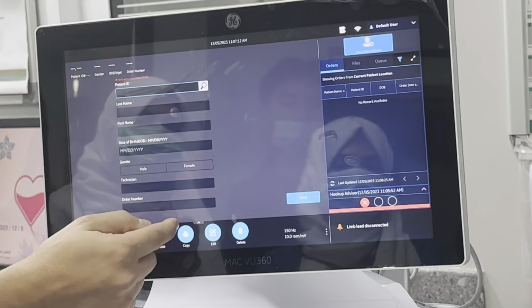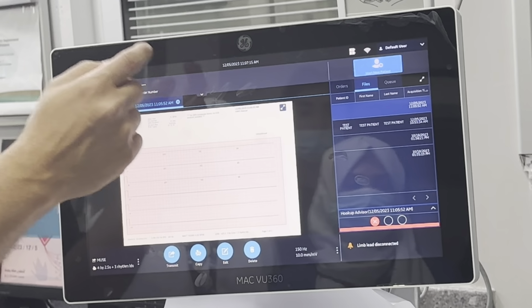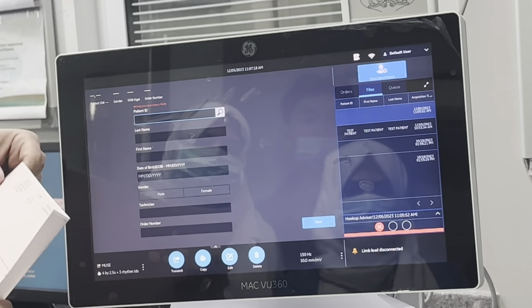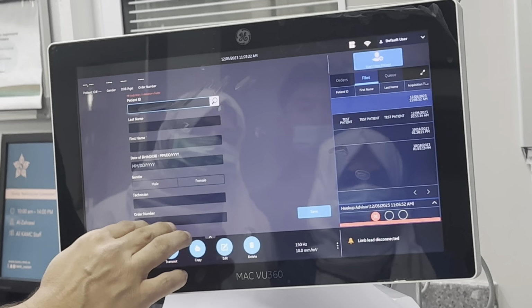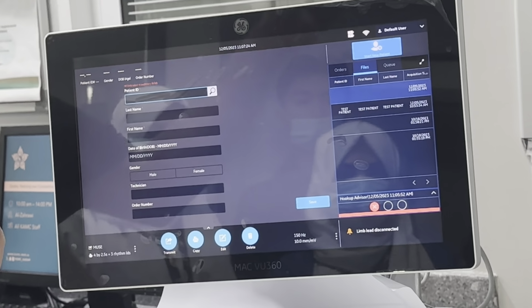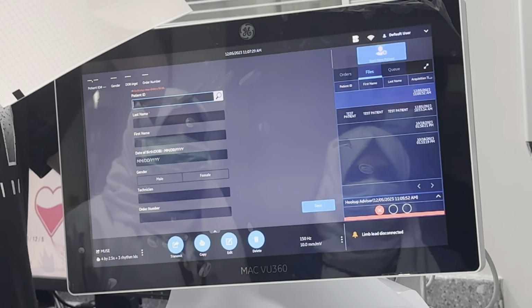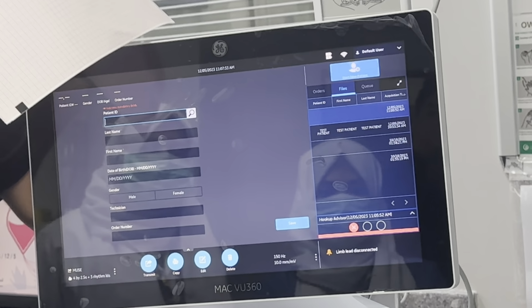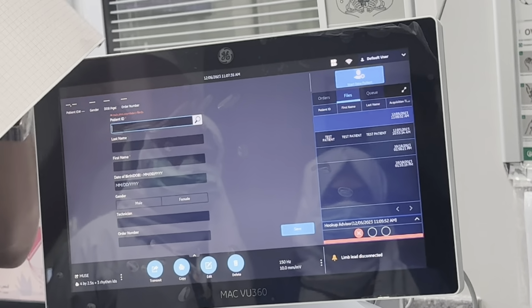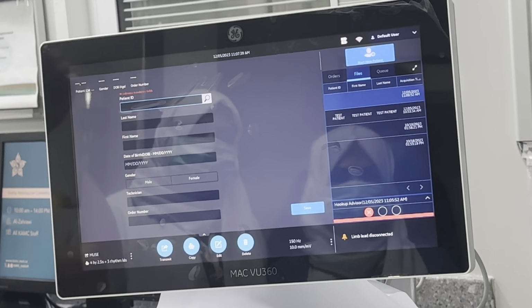This is one way. The other way, if I open that report, after placing an order in the system, I can get back here, fill all spaces manually with the order number attached, do save, and send it to the patient's profile. This is a really important ECG because it has the event on it. Even if the patient has chest pain, you have the event. It's really important for the patient to be saved. So you have to fill the spaces and send it to the patient profile.